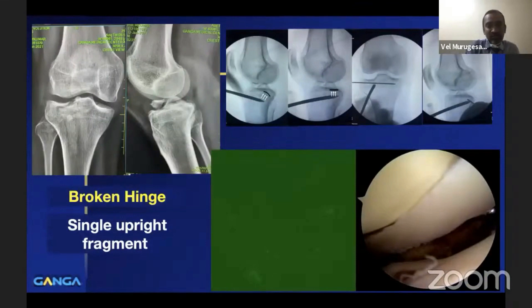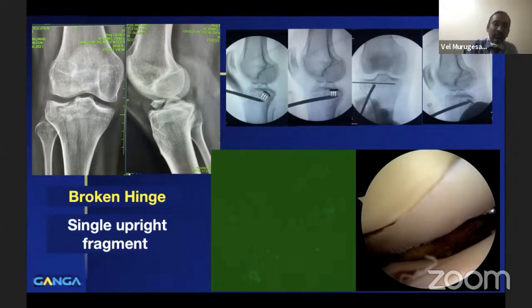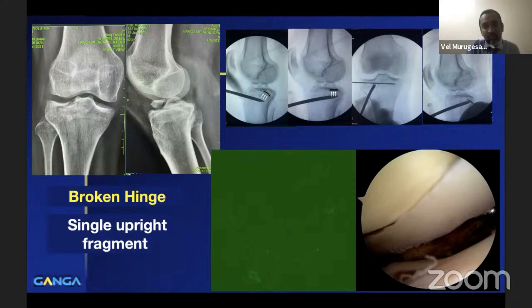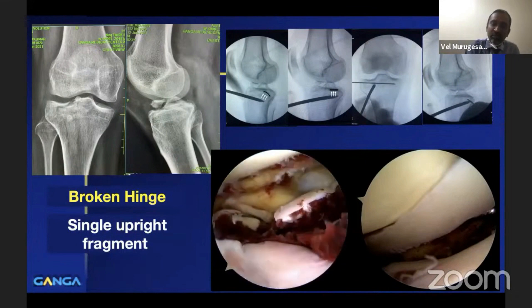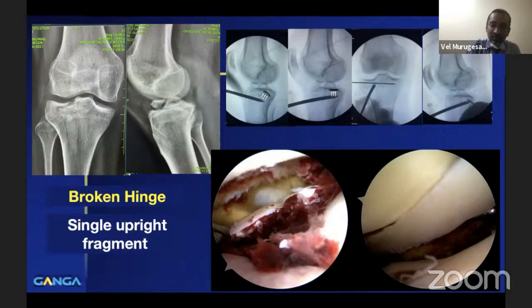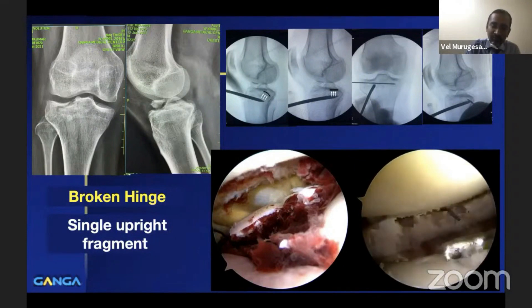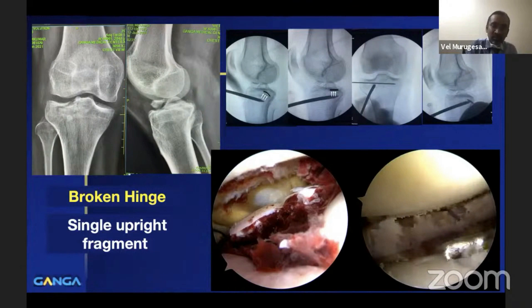When there is a broken hinge with a single upright fragment — where the articular surface is still parallel to the rest of the bone — we can elevate with the pin technique, but joint visualization is required during elevation. In this patient, there was also an ACL avulsion. Arthroscopy was performed; the pre-elevation arthroscopic video clearly shows the crater, and the post-elevation video confirms the defect has been filled by the elevated fragment.